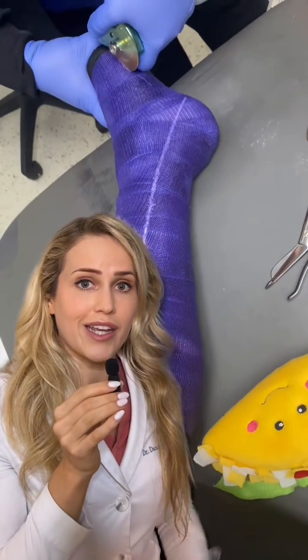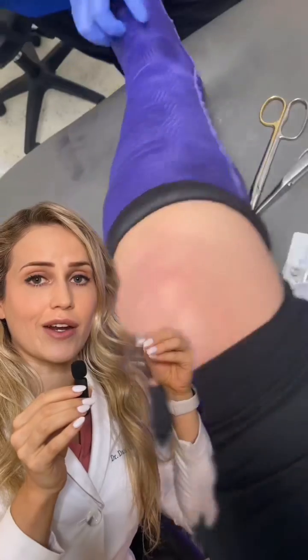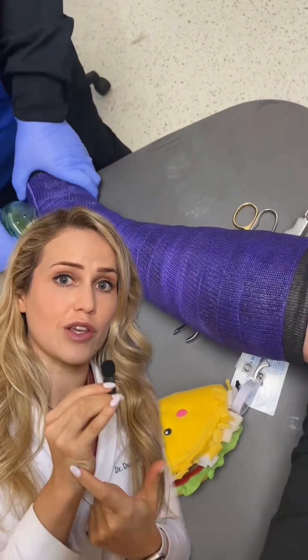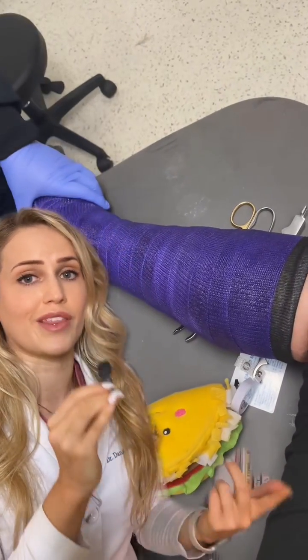How they actually work is they oscillate back and forth a very tiny amount — so much so that they can only cut through hard things like this plaster cast, but if they hit something soft like the soft tissue of your skin, they just move it back and forth without cutting it.